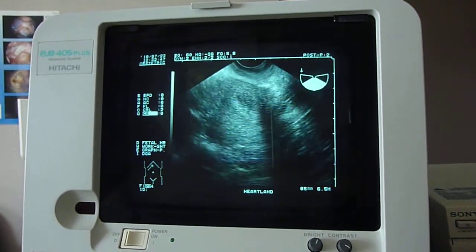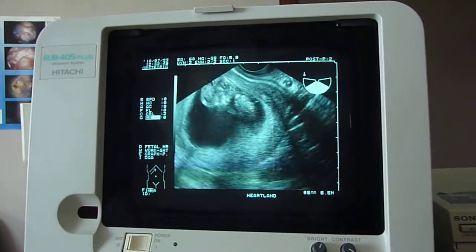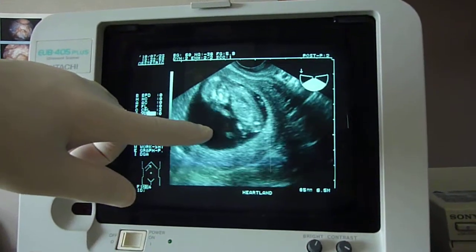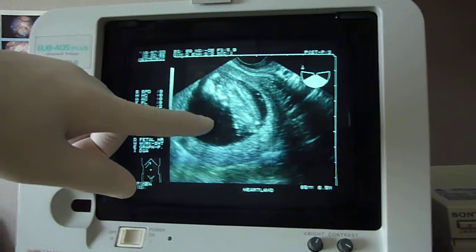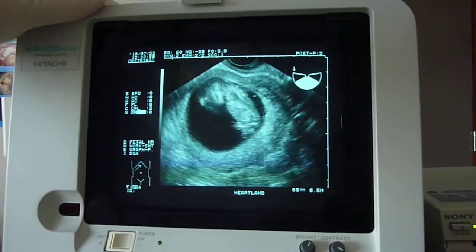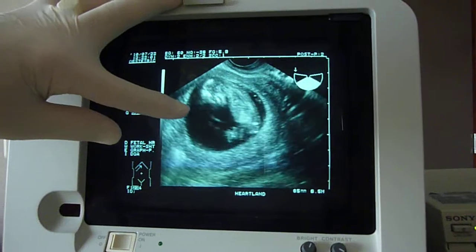So when we take a look at the rest of the gestational sac, there's baby — you can see baby moving. There's hands moving, baby's kicking around, so you can see movement already inside. That's always a good sign — there's the baby moving, it's moving out of the screen.